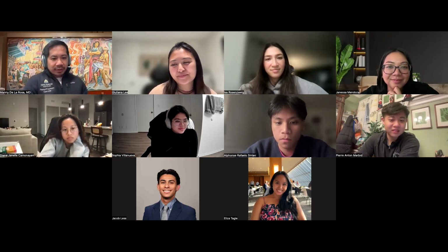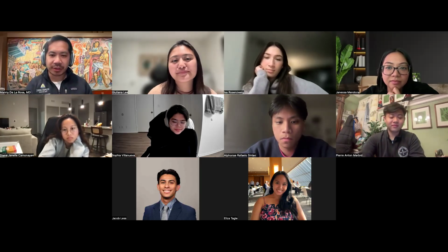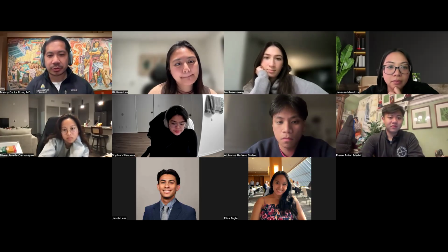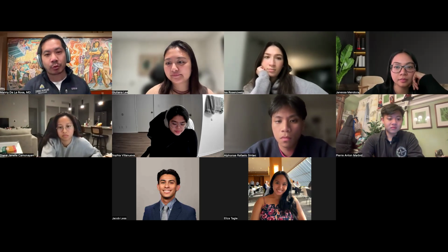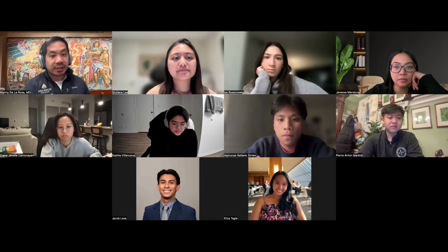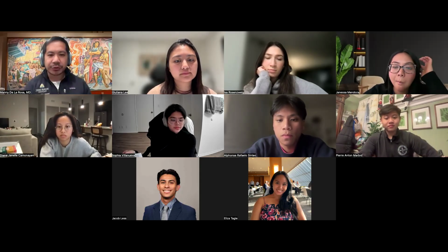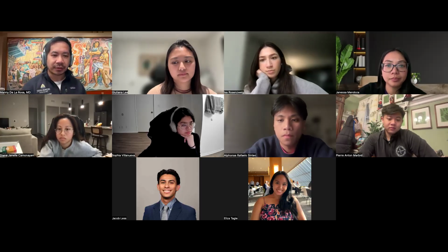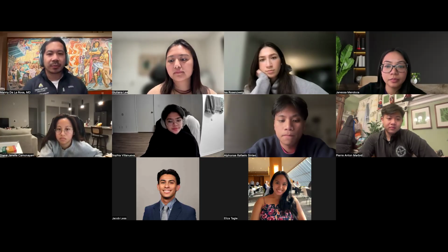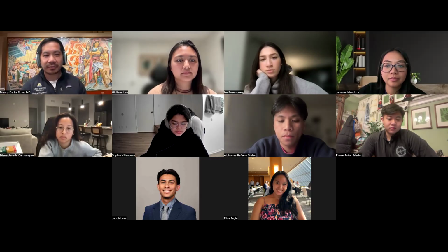Yeah, so I will echo what's already been said that it's best to take a systematic approach. That way you won't miss anything critical, especially. And one thing that I love about what we did here is that we showed you all some very life-threatening emergencies that can show up on a chest x-ray that require immediate action. And remember, a chest x-ray is one piece of clinical data. So whenever you're presenting your chest x-ray findings on wards, it's best to tell us you see an opacity in this particular location, or I see blunting of the costophrenic angles. So just state what the findings are, because then you're going to put that together with all of your other clinical information to form your assessment, which then will drive your plan.